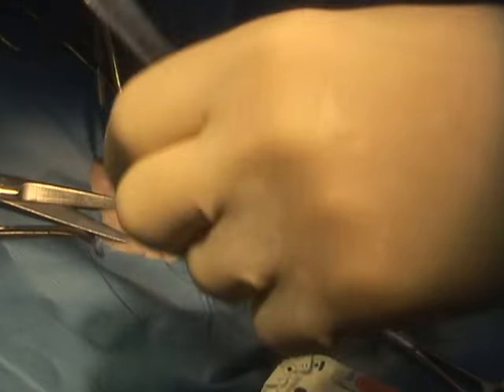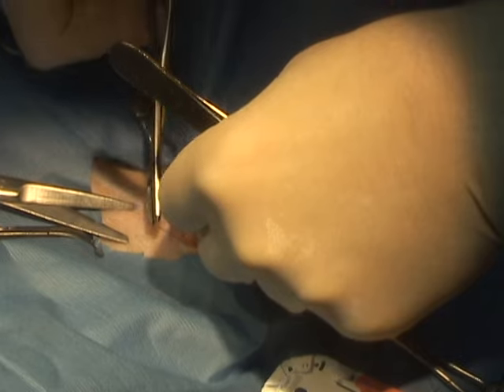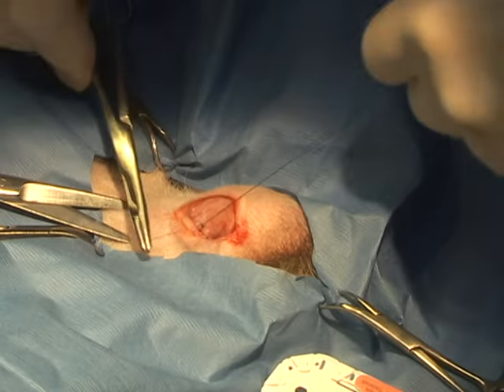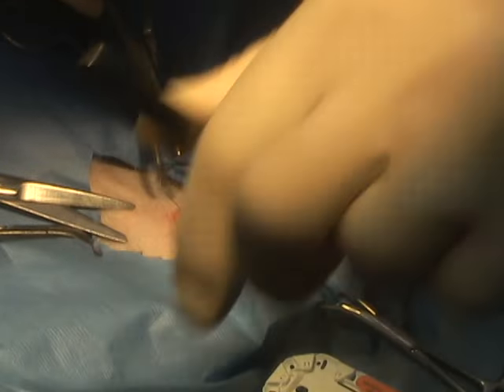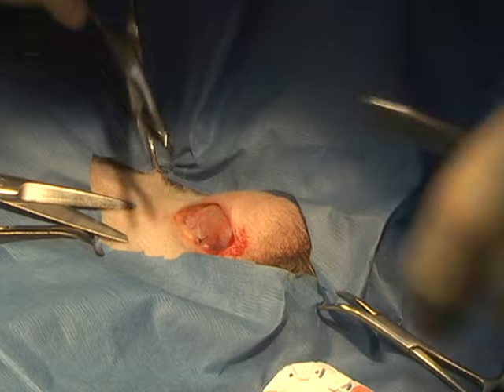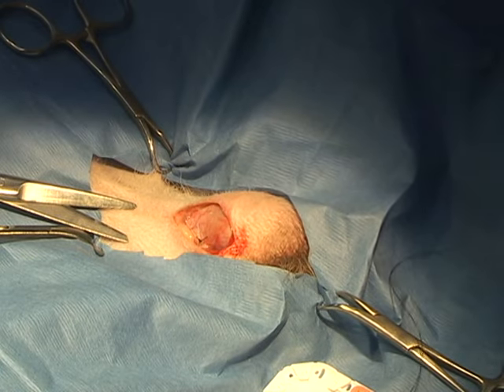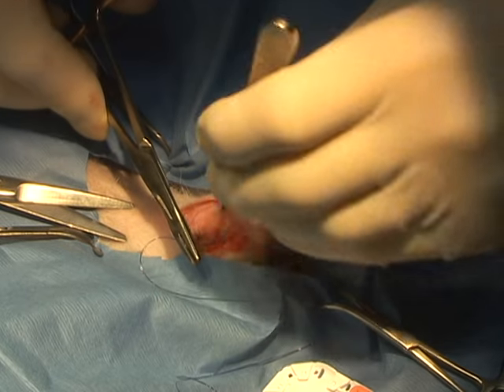We are using 2-0 monofilament for the procedure. There's no problem with reabsorption of this, and fewer issues than using, I think gut sutures would be a mistake in something like this just because of the tissue reaction that you get from gut sutures. But monofilament PDS, one of the monofilament reabsorbable sutures, would be just fine for this procedure.